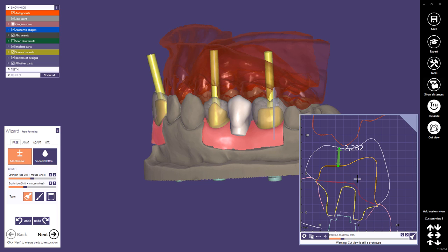When clicking near a line while defining the measurement arrow, the arrow will snap to it. If you click an empty space, the arrow will still appear, but it will be yellow, as this measurement mode is typically less useful.